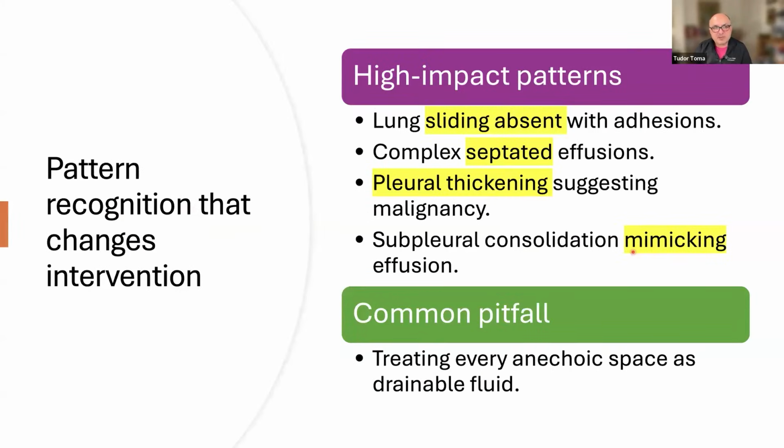Just a couple of words about pattern recognition. What does this mean? We use pattern recognition for diagnosis. Again, interestingly, ultrasound is very helpful for diagnosing patterns suggestive of interstitial lung disease, and therefore it will help with the diagnosis of interstitial lung diseases. And then we can go and clarify this diagnosis with a cryobiopsy and so on. However, I said I'm not going to stress the importance of ultrasound in diagnosis, but more in procedures.